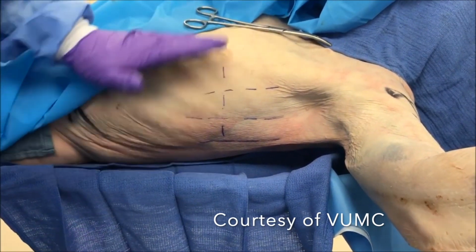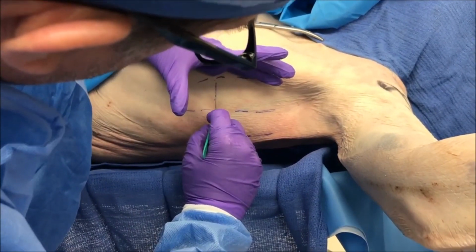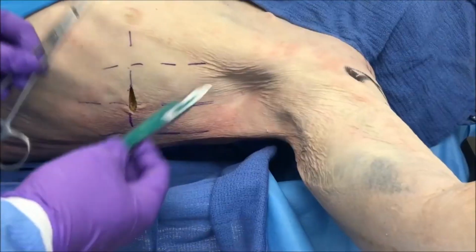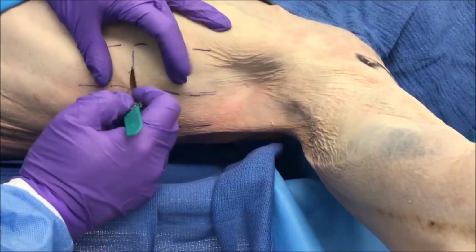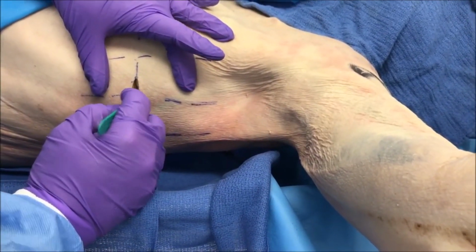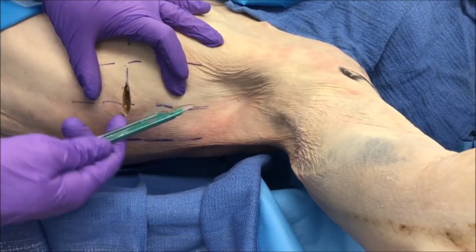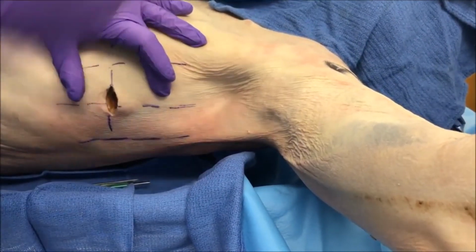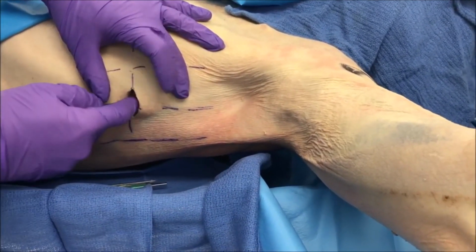The procedure is completed in the 4th or 5th intercostal space mid-axillary using a large curved forceps or Kelly clamp and a scalpel. Just above the rib, a 1-inch incision is made. After that, the curved forceps will be placed into the hole and pushed until it pops through the pleural lining.